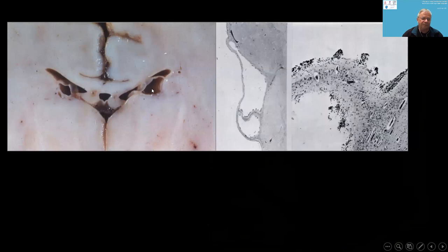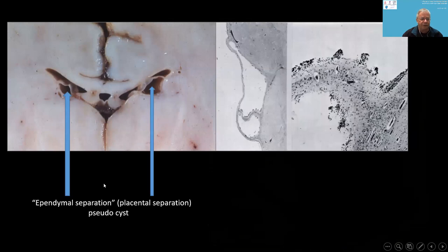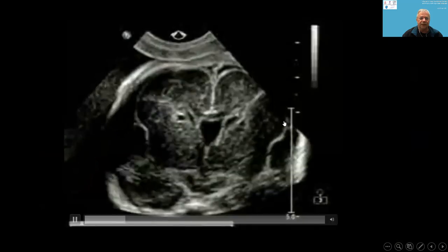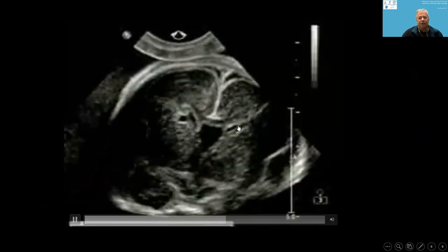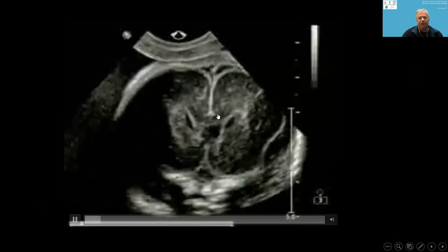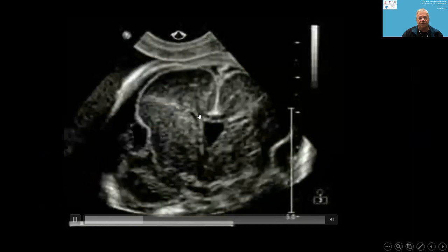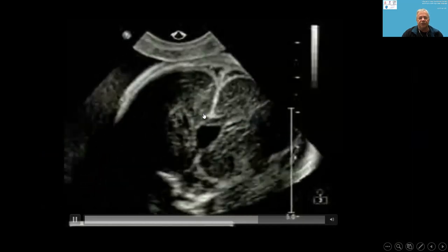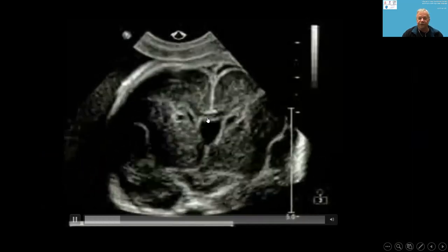We call them pseudocysts because it is like an ependymal abruption — similar to placental abruption. It is not a real cyst, it is a pseudocyst, and we can see there is no true cystic structure. These are ventricular sub-ependymal pseudocysts seen in the third trimester.